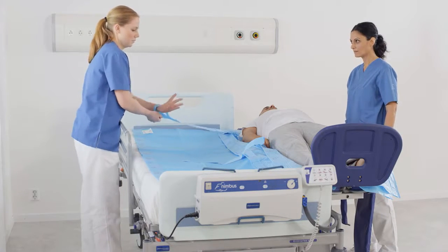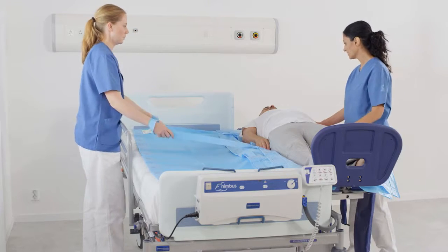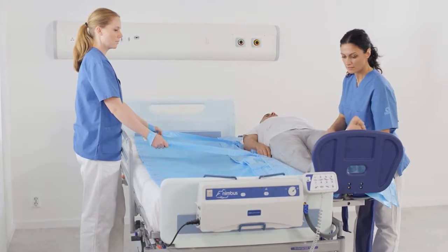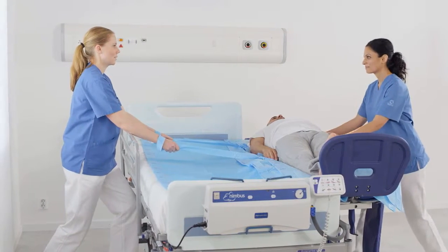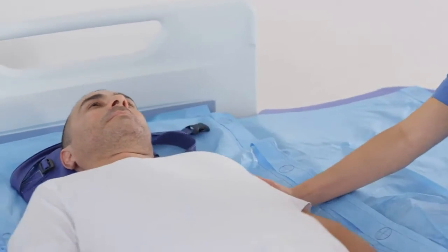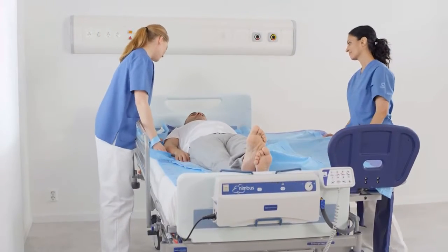Caregiver 1 inserts hands into wrist loops, or, if extension straps are not available, grabs the handle of sliding sheet. Caregiver 2 ensures that the patient's feet are suitably positioned and free of obstacles. Caregiver 1 gently pulls the wrist loops to transfer the patient, while Caregiver 2 gently pushes the patient over to the bed.